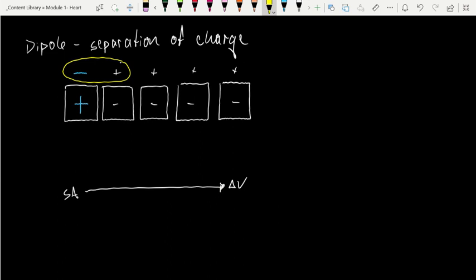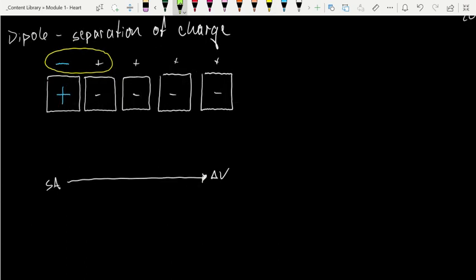So with that in mind, let's just go through a quick review of how this electrocardiogram works. First of all, we need what are called leads. On the simplest of EKGs, we've got a 3-lead system. On more complex ones, typically if you're going to go in and get a good readout, they're going to give you 12 different leads. What I'm going to show you is just 2 leads to establish the principle that we're looking at. On one end we have a negative lead, and on the other end we have a positive lead. These are physical wires actually attached to the skin in specific locations that are going to give the machine the chance to read the dipole moments established by these dipoles.